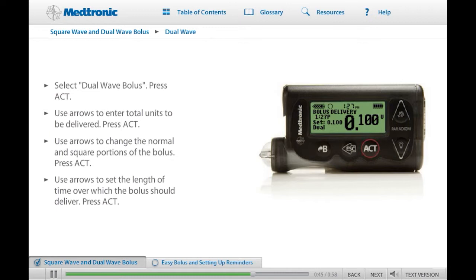If you are practicing with your pump to prepare for training with your health care provider, try programming a Dual Bolus now. Please ensure that you are not connected to your pump while you practice. When you are ready, click Next to continue.